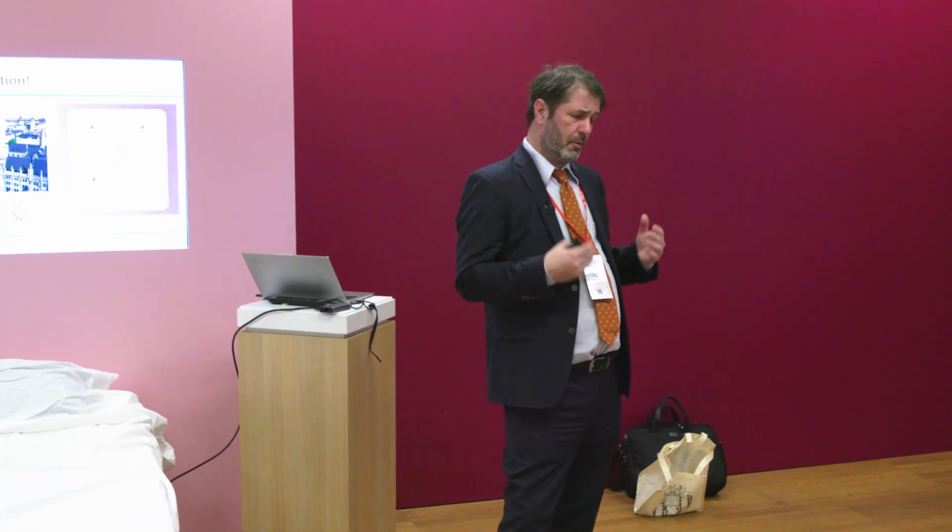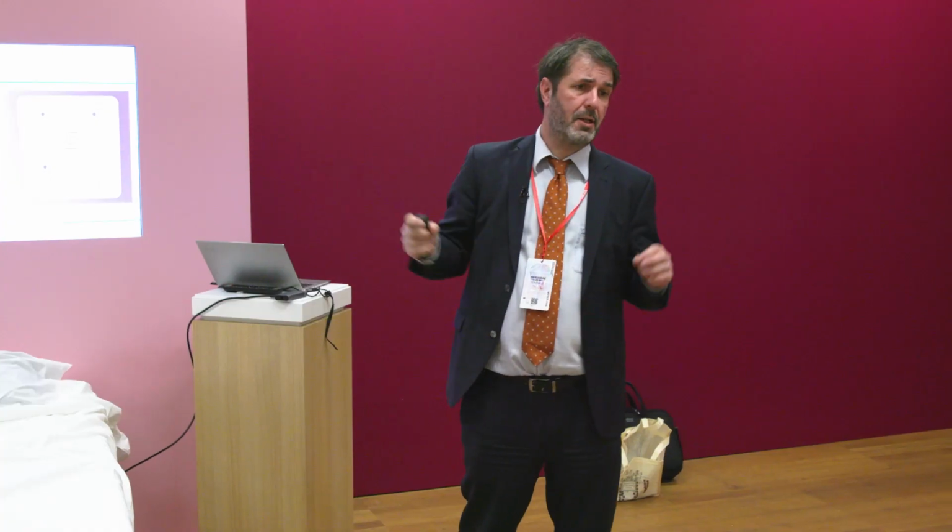For example, prostate fusion. The best technique for detecting prostate cancer is MRI. The problem is, if you do the MRI biopsy, it's very time-consuming and it's expensive. But if you use the advantage of fusion, then you have your MRI prostate on the right side. On the left side, the real-time ultrasound.